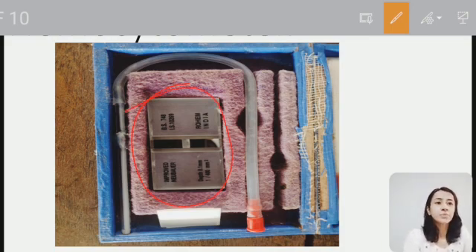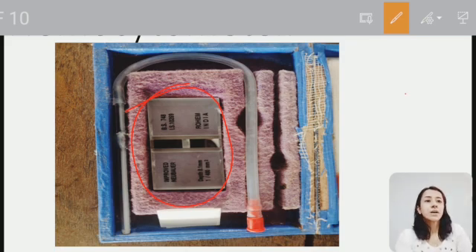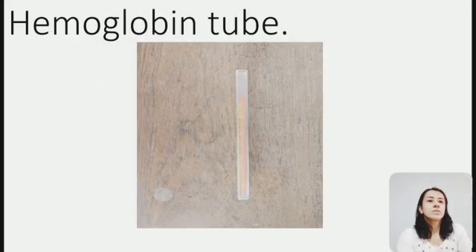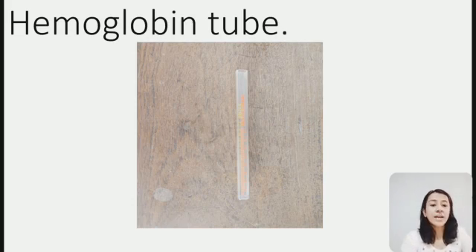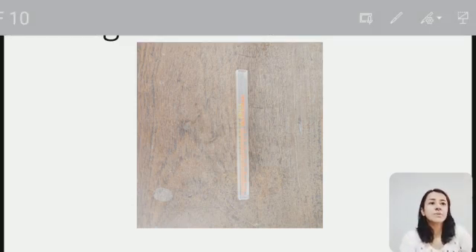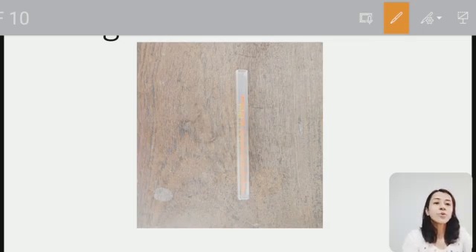Next is the hemoglobin tube, which is also known as the square tube because it is square in shape. You can see here this is a square tube.